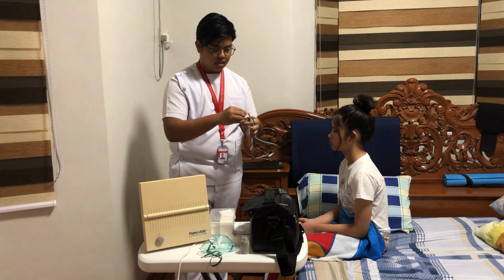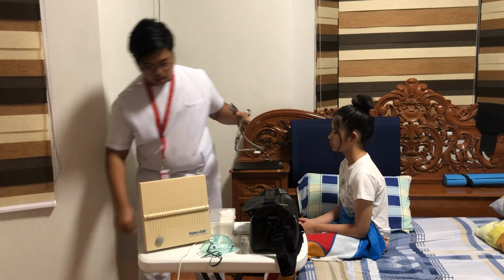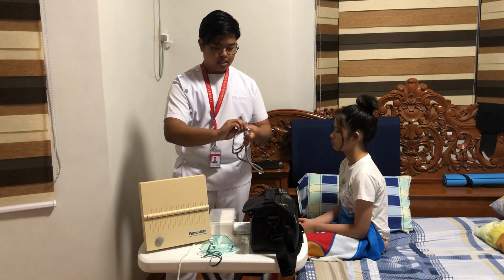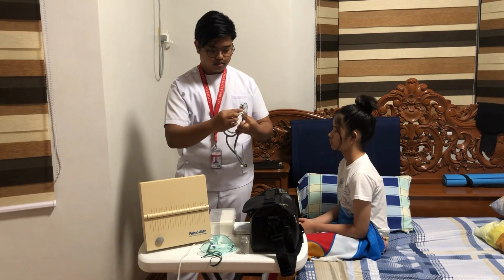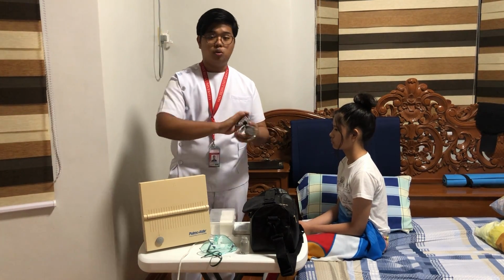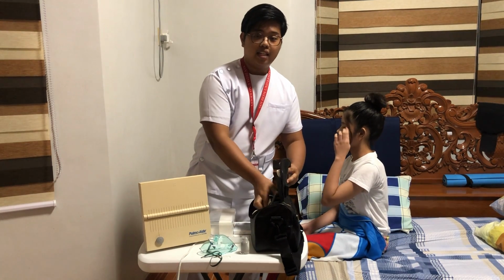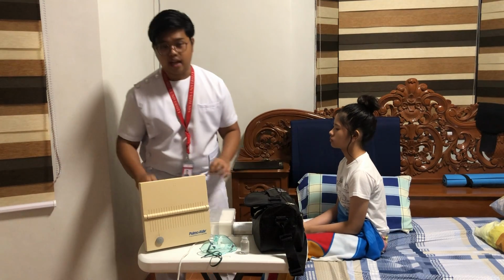And then the bell. And then discard. And then we also need to clean the earpiece. We can also clean the tubings. And then after doing so, we need to keep our stethoscope within the bag. And then again, we need to perform hand hygiene.